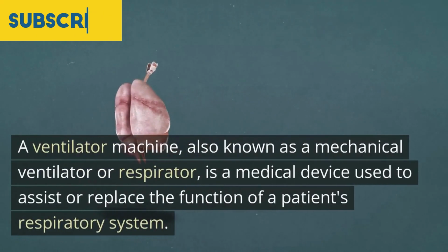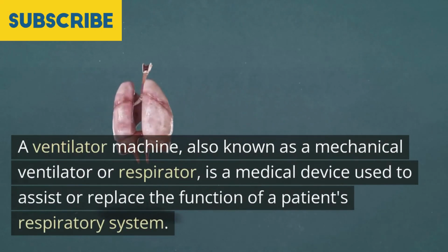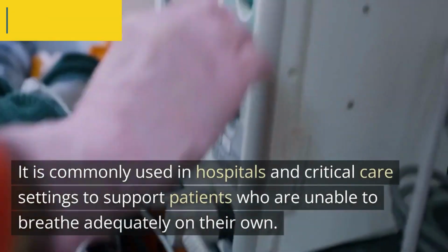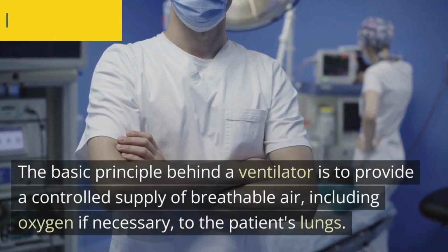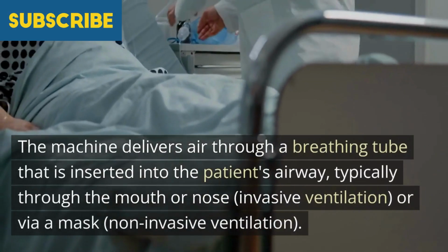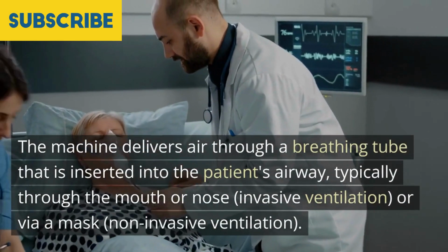A ventilator machine, also known as a mechanical ventilator or respirator, is a medical device used to assist or replace the function of a patient's respiratory system. It is commonly used in hospitals and critical care settings to support patients who are unable to breathe adequately on their own. The basic principle behind a ventilator is to provide a controlled supply of breathable air, including oxygen if necessary, to the patient's lungs. The machine delivers air through a breathing tube that is inserted into the patient's airway, typically through the mouth or nose, invasive ventilation, or via a mask, non-invasive ventilation.